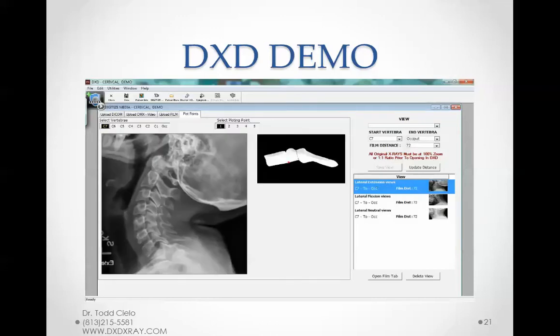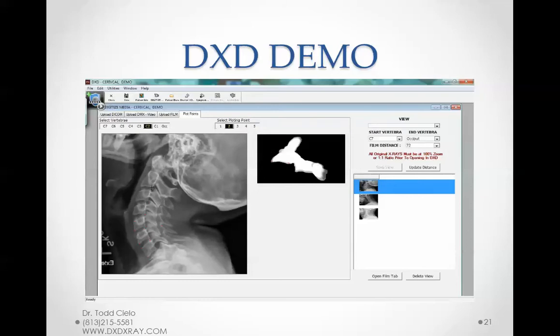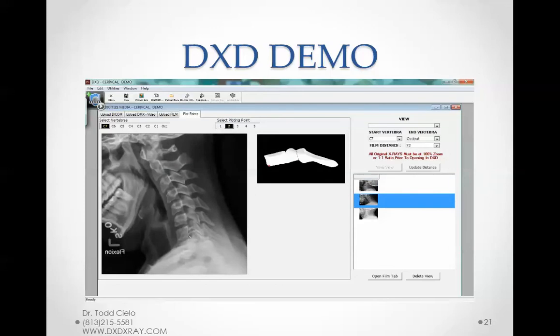And now we're going to digitize, plotting of the points. You plot the 4 ends of the cortices and the spinal lamina line. What we're evaluating here is George's line. George's line is the posterior aspect of the vertebral bodies. And if there's a break in George's line, there's only 4 reasons for the break: a fracture, dislocation, degenerative changes, or ligament laxity. Ligament laxity is the reason why we're doing what is called CRMA, Computed Radiographic Mensuration Analysis.